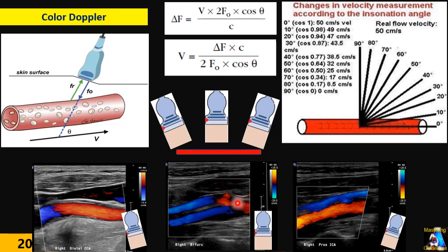If with steering or heel-toeing, it shows some blood flow there, that is because of the principle of the sound, and at that area blood flow was perpendicular to the sound wave pulse. If not, with optimizing the image, there is some pathology, and we have to do more maneuvers, optimizing, different angles, short axis, and all the stuff that is out of this lecture. Later we talk about the plaque and pathology on the CCA, ICA, ECA. I am going to talk about that in another lecture.